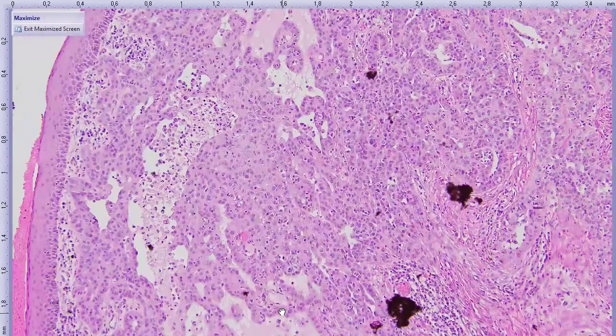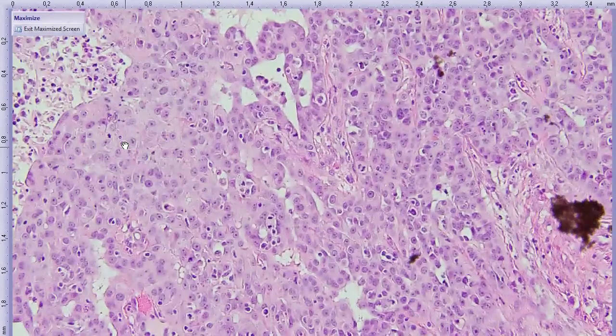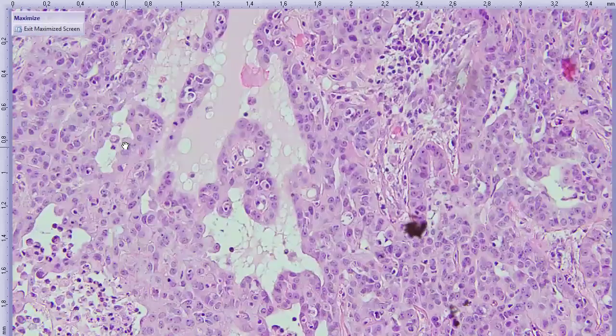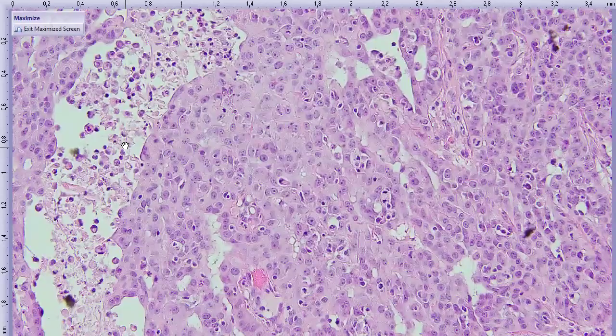Why do I say epithelial? Well, first, these cells have no business being here, so we know that's something wrong. Second, we got cords and trabecular cells forming these cystic spaces filled with cells that are detaching probably, or degenerated cells.